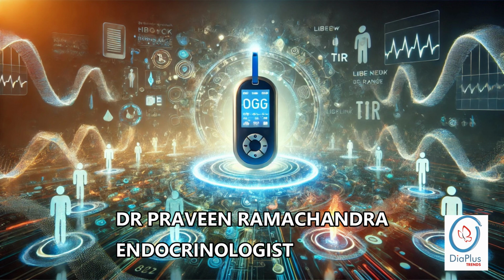So how does time in range, this TIR, help us really grasp these variations in our glucose levels? Well, TIR gives us a much more detailed look. It tells us how much time your glucose spends within the target range, usually between 70 and 180 mg/dL. So instead of just a simple average, it tells us what percentage of the time you're in that sweet spot. And it also shows how often and for how long you go above or below that range. So it's like a detailed logbook of our glucose throughout the day. We can actually see those peaks and valleys.